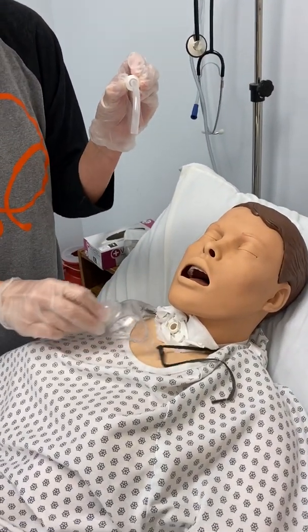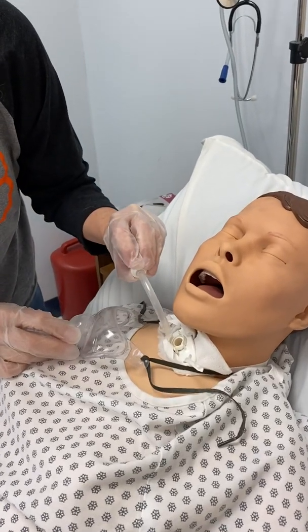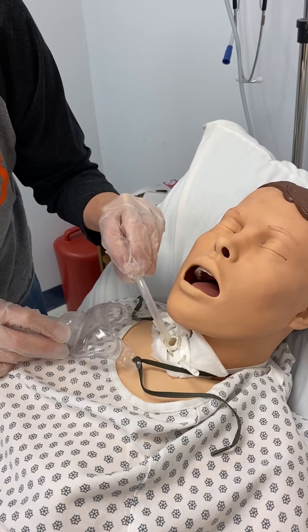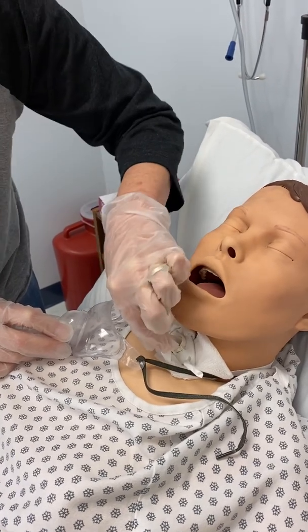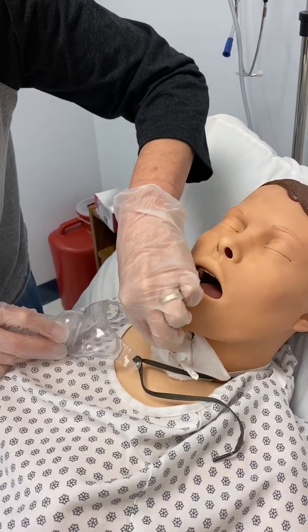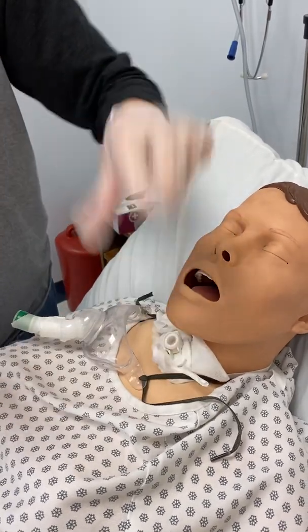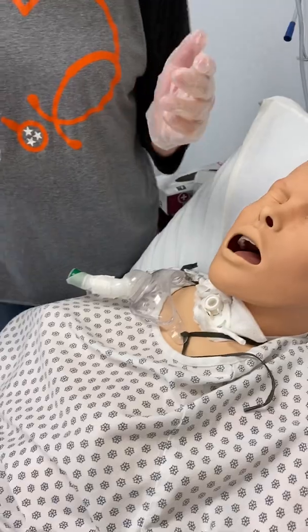This is the end of the sterile process, so I'm going to move this over. And I have to put that in the hole without hitting the outside. I'm going to put it in. Then I am going to click it to lock it. Okay, so that's the end of the sterile process.